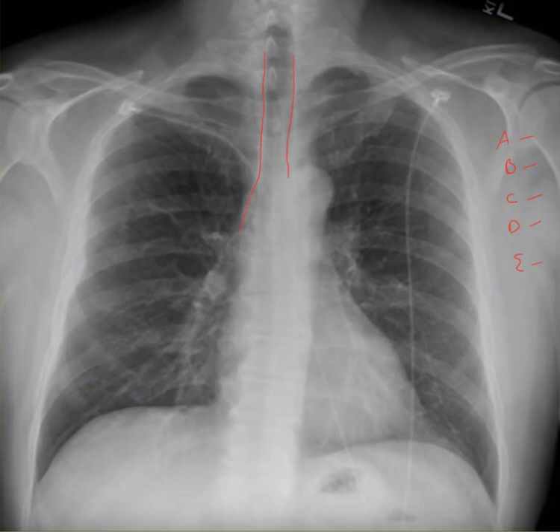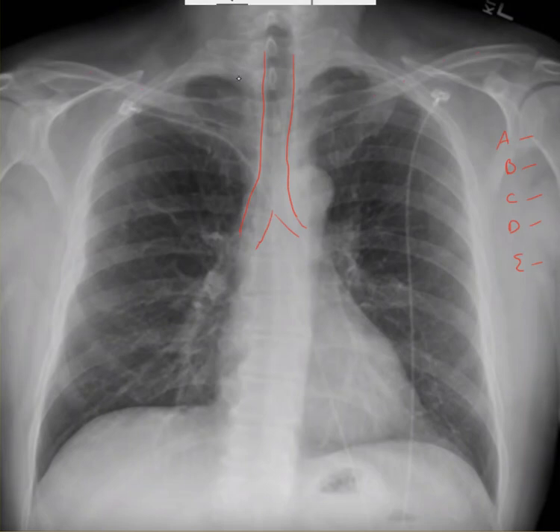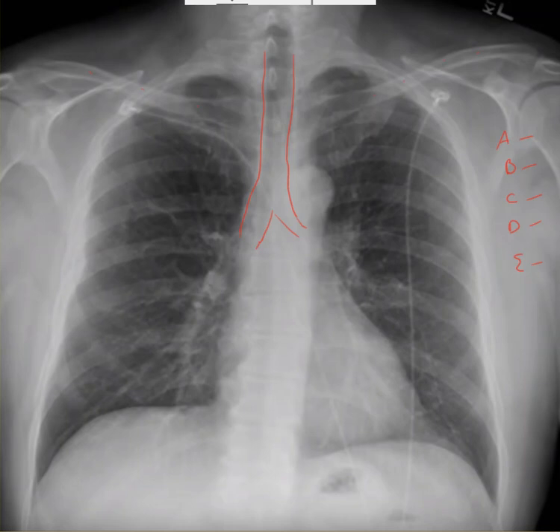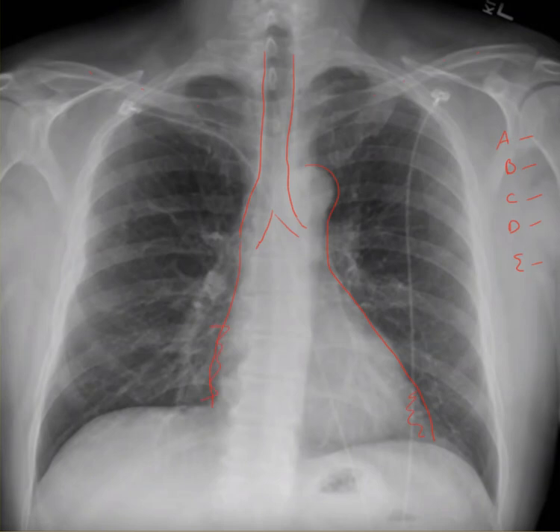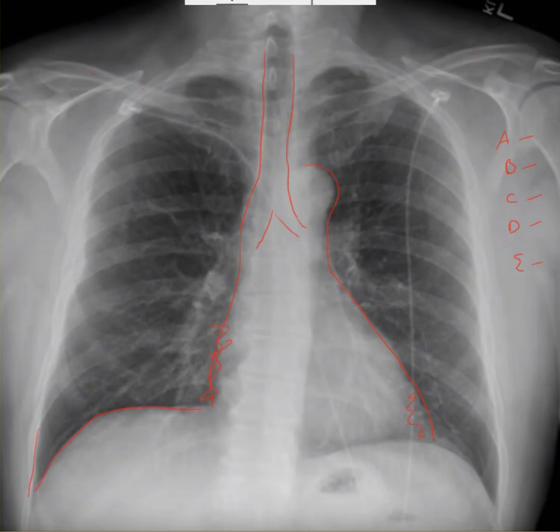Real quick — airway: the carina is about right here, right main bronchus, left. Look at your bones — clavicles, no fractures. Look at your ribs, go over each rib, looking at the posterior and then following around to the anterior ribs — a little harder to see on a PA. Do both sides; don't see any fractures. Cardiac silhouette: make sure you can see all of the cardiac silhouette and nothing is blocking it. If something is blocking a portion — for instance here or over here — then you could have a right middle lobe process or maybe a lingular process going on. Look at your diaphragms — costophrenic angles look good, make sure you can see all the diaphragms on both sides, make sure the right is slightly elevated and it looks good.